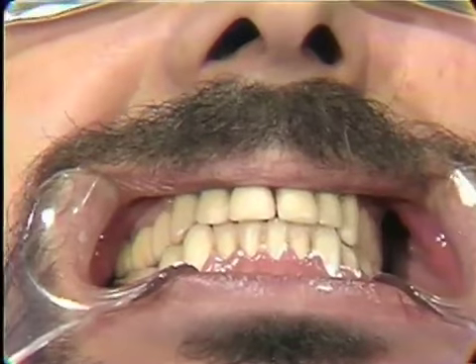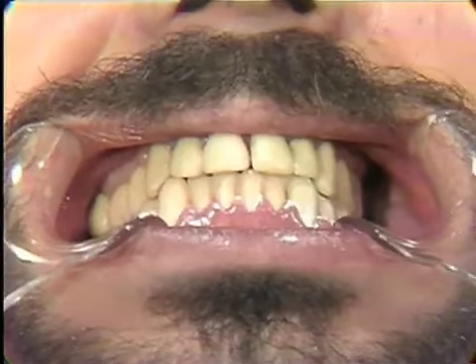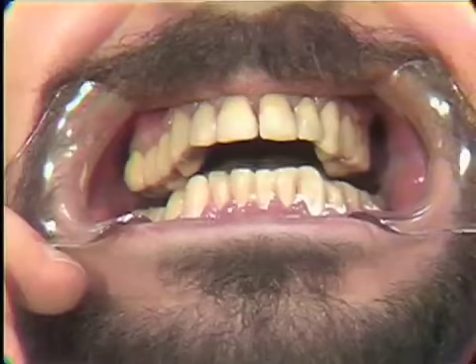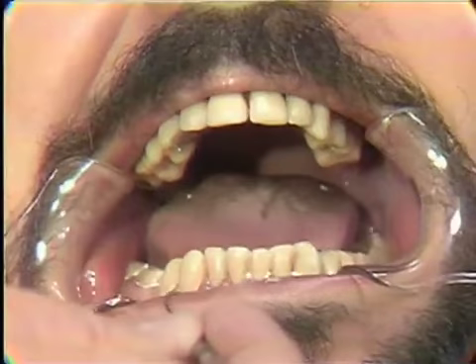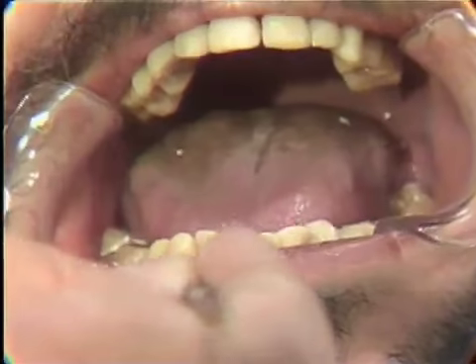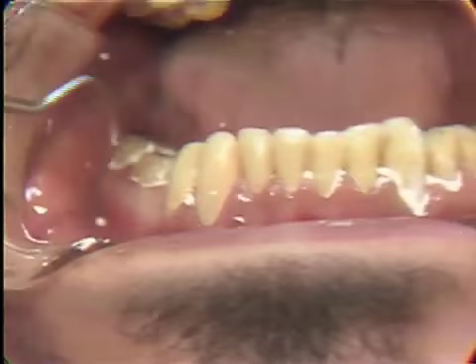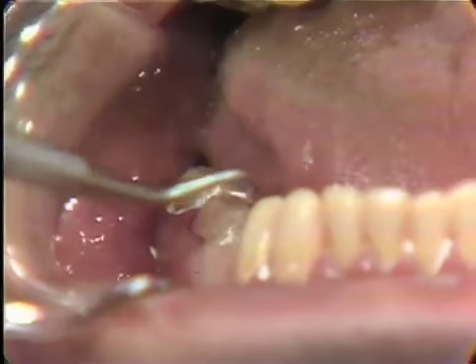Now with all the temporaries in place, we just let the material set up to a crisp consistency, then we will clean it out. When the cement sets up, you can check this by seeing if it breaks away cleanly from the temporaries. Go around each one of the teeth. I like to use a scaler to go around the teeth and get rid of this cement.